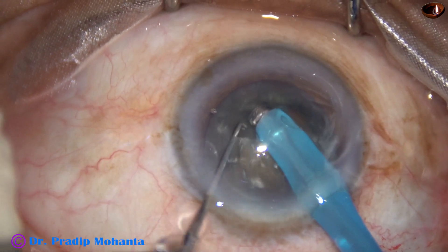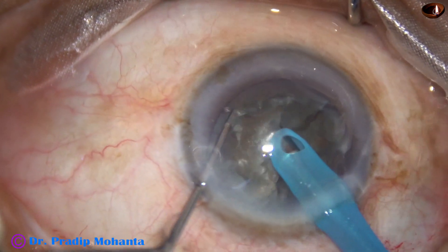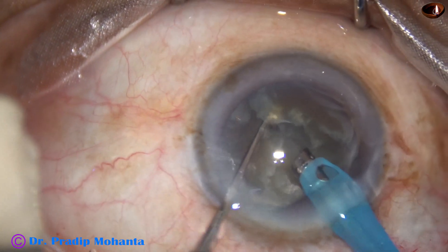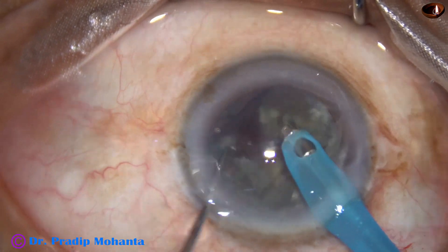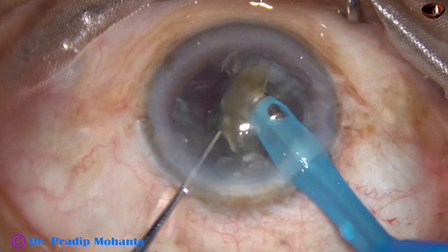The nucleus is rotated 180 degrees and the two pieces are completely separated. This is another chop on a hemi-nucleus and another chop on the other hemi-nucleus, and the fragments are now emulsified.